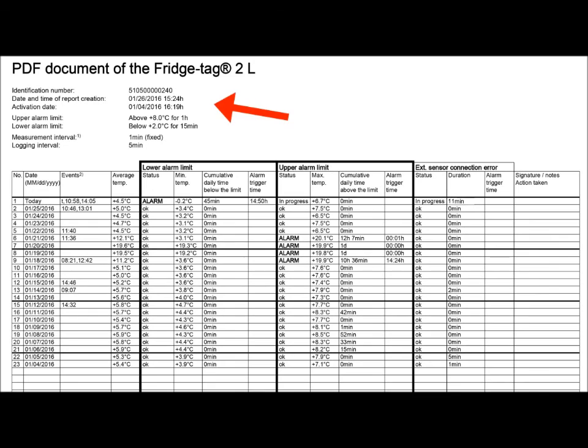At the very top we see the serial number of the device in the report, the date the report was generated, and importantly the date this data logger was activated, which can be helpful when reviewing for recalibration.